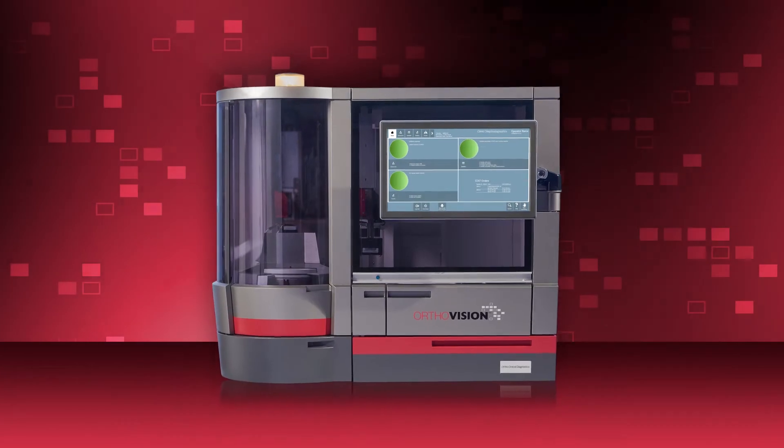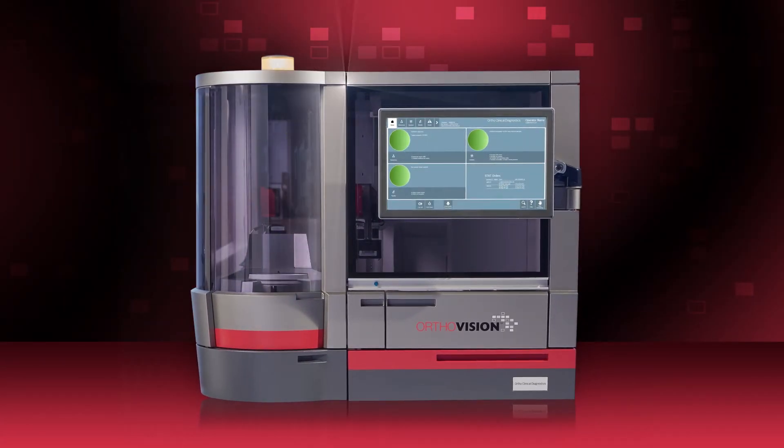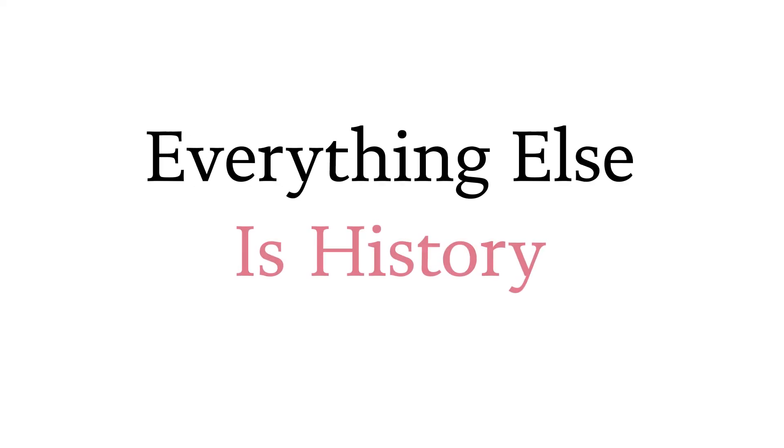The OrthoVision Analyzer — it's the future of automation in transfusion medicine and it will change the way you run your lab. Everything else is history.